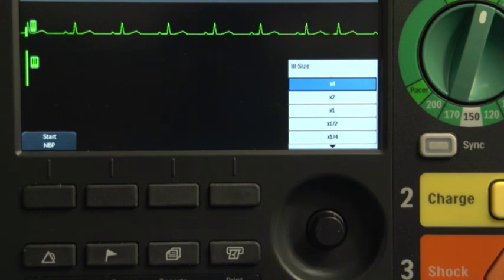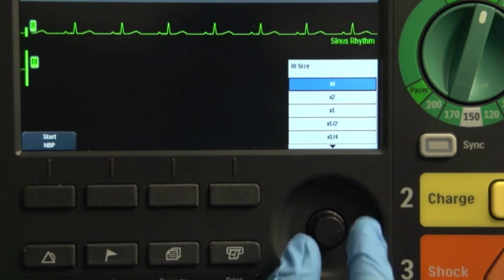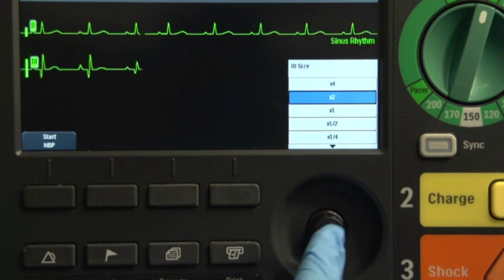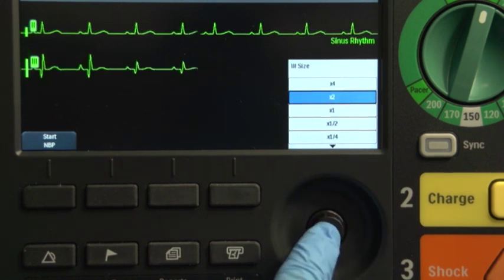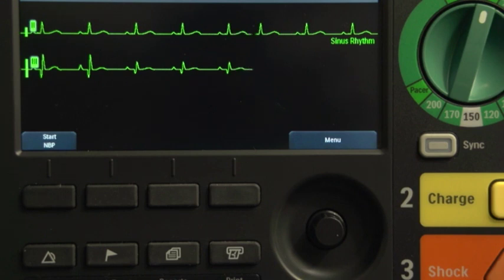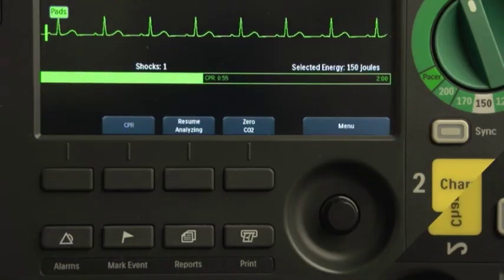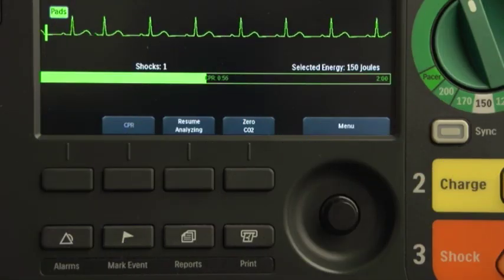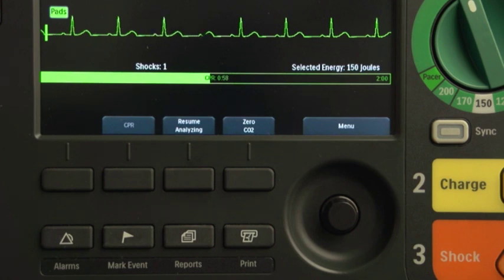If needed, select the appropriate ECG wave size and press the Smart Select knob. In AED mode, the pad's ECG wave is automatically populated in WaveSector 1.